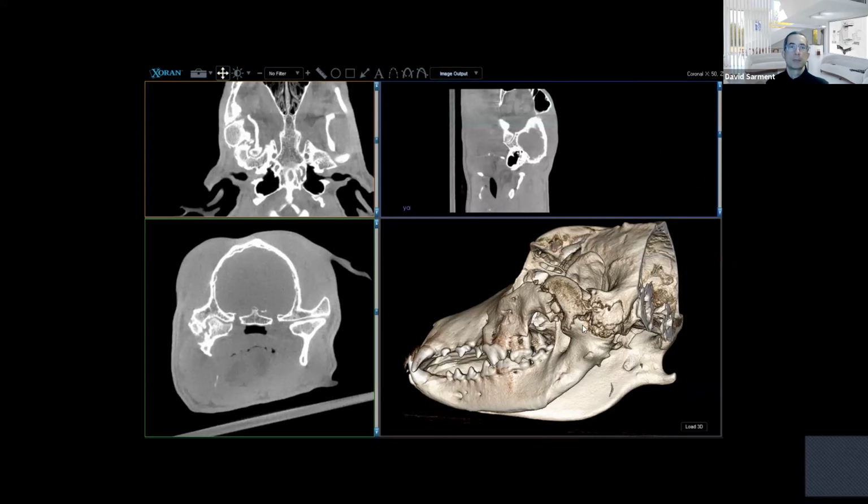That's really an interesting question. We actually are trying to chase that a little bit more now as we speak. At the moment, you have to look for stable anatomy, say the distal of this tooth. You can take a measurement on the screen from one spot to the next and say, okay, I am 12 millimeters from the distal of this tooth to where I want to do my cut. So you can go in the surgery and measure that.